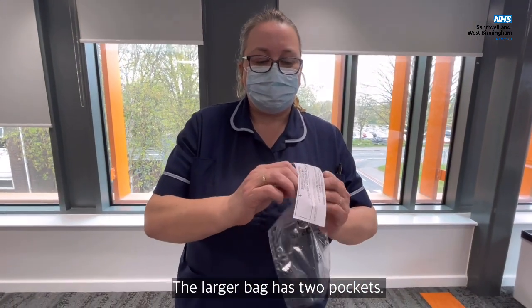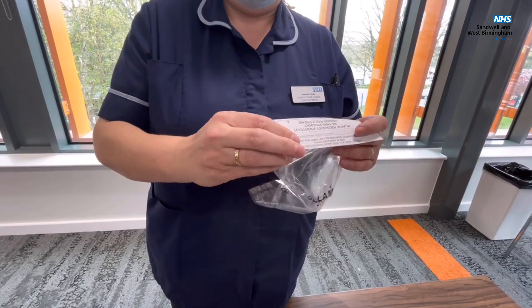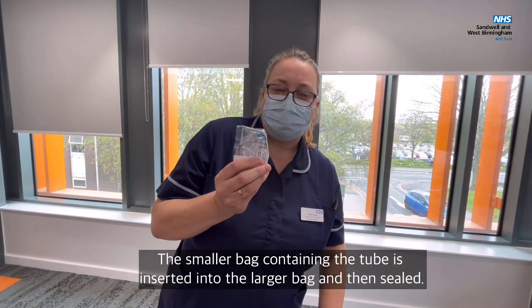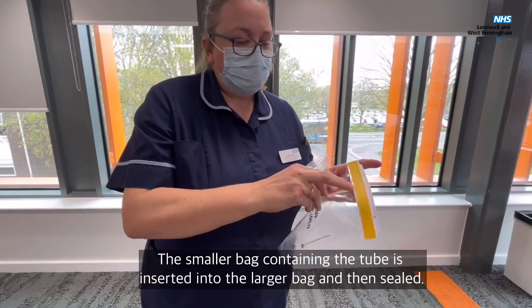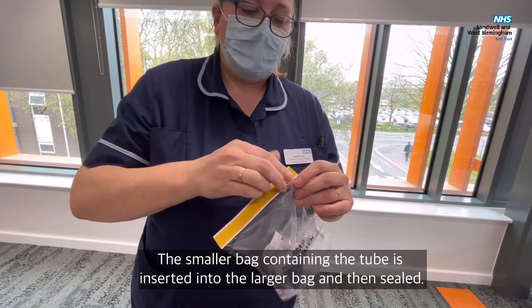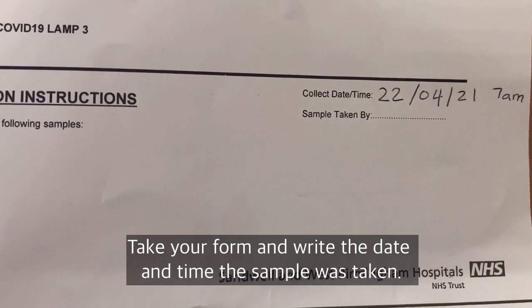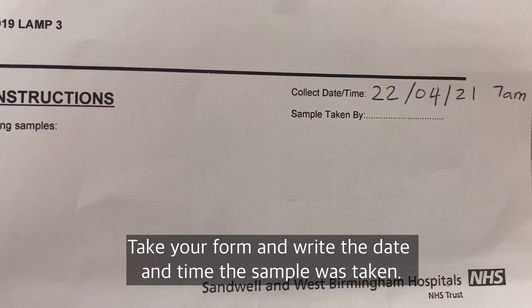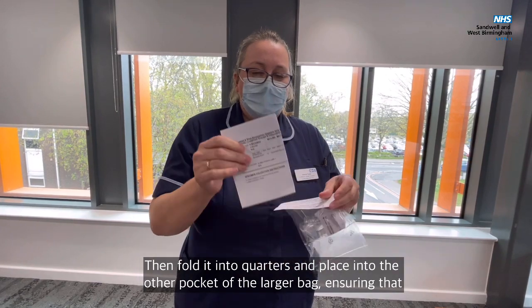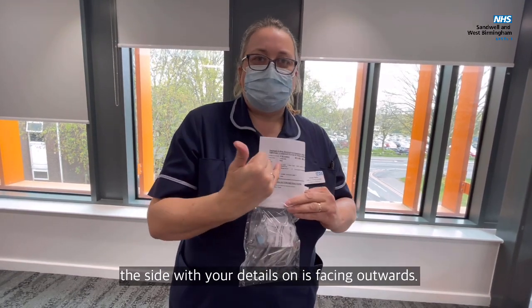The larger bag has two pockets, one which you can seal. Take the tube and the sealed bag and put it in the larger bag and seal the bag. Fold it into quarters and put this into the outer pocket with these details facing forward.